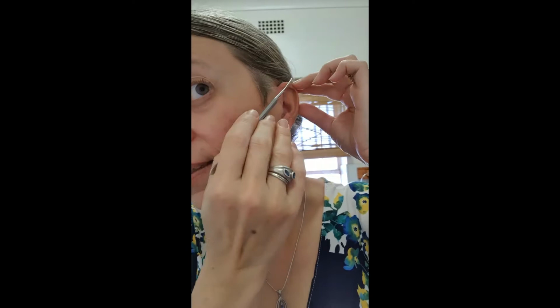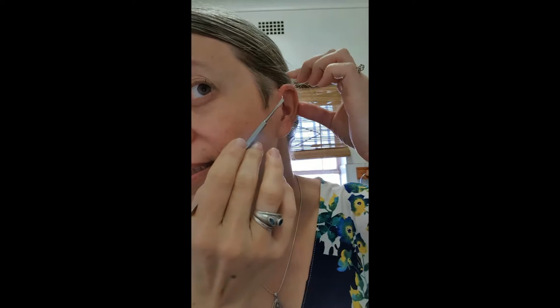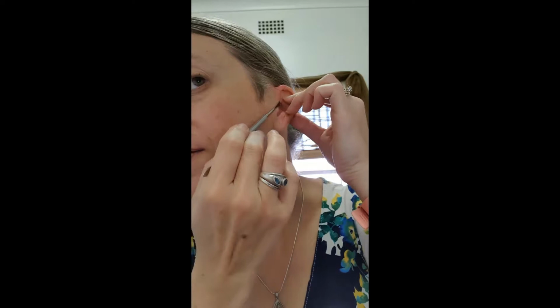This is actually a very nice and quick effort. There's a little glue. We'll sort that out just now. And here. And that is also looking quite fine. And now typically what I do is I look in the mirror to check. I can look in the phone as well. The ear is the same size, because if they're the same size, it means that this ear is pushed on properly. As I told you, there's a little bit of glue there, just sticking away, and I'm getting a little scissor, because the problem is I can't pull it off. I need to cut that glue off.